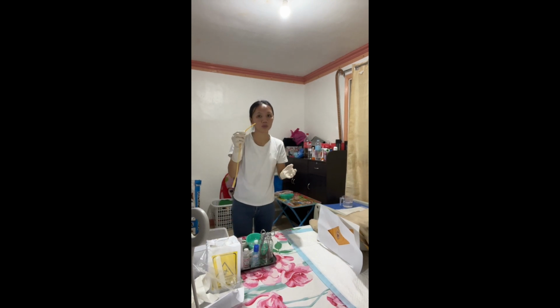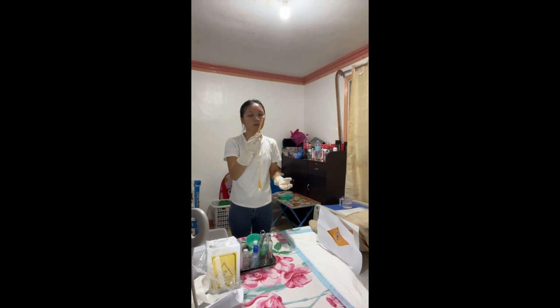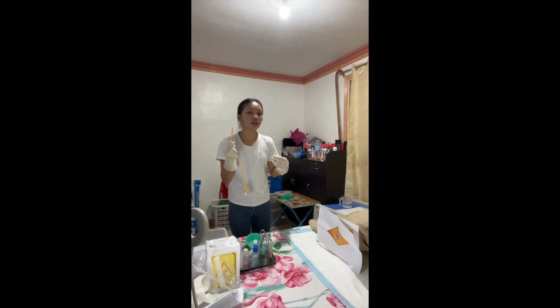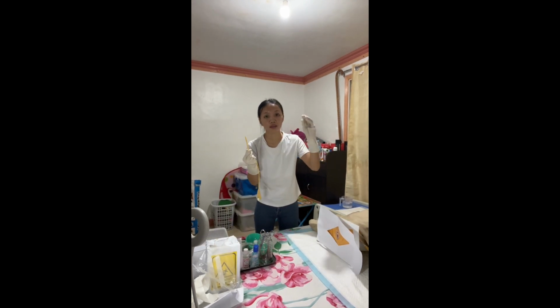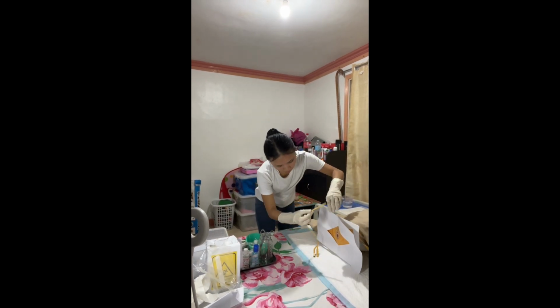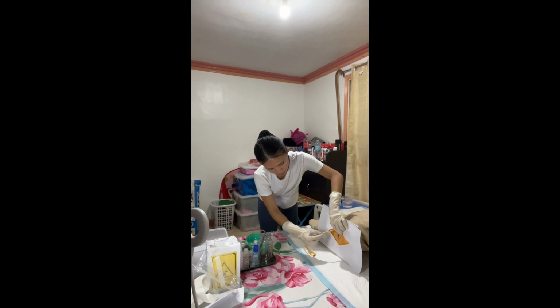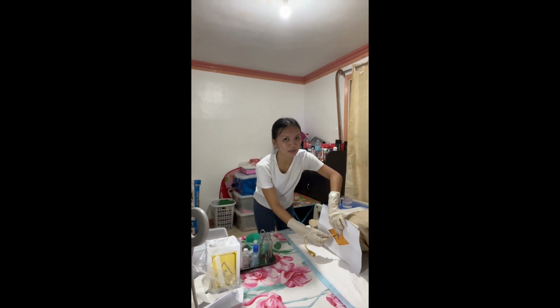Now we are going to pick up the catheter at least 3 inches from the tip with our thumb. Place the thumb and one finger of the left or right hand between the labia minora. Separate and pull up gently when you touch the labia minora. Separating the area surrounding the meatus provides visibility of the meatus.